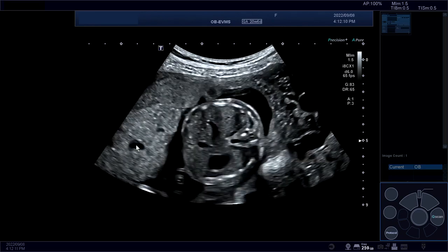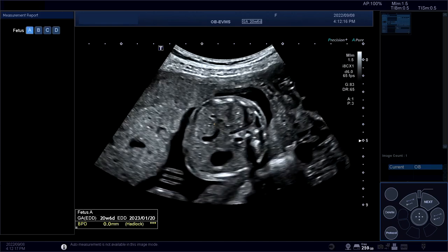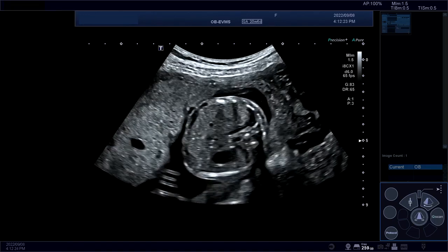Let me see, how do I do that? Yep, that one, and just roll, and then, okay, let me get rid of the arrow. That one, and just roll it. Okay. Sorry, my hands are pressing all different instruments. Yeah. You're fine. Okay. This one? Yeah.